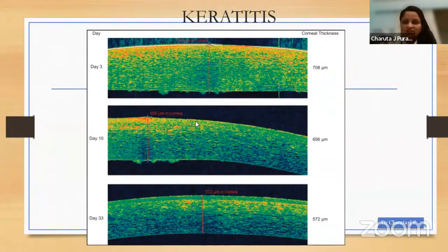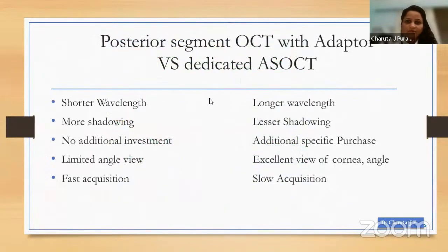Another interesting application is in keratitis, although personally I have never used it for this indication. It has been shown to detect fluid clefts, to distinguish between necrosis and inflammation per se, and also to serially detect the resolution of edema in stromal keratitis cases.